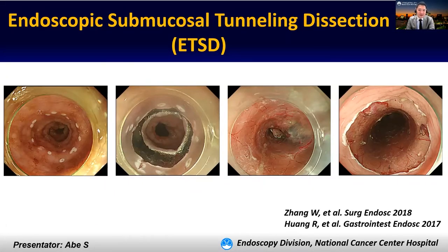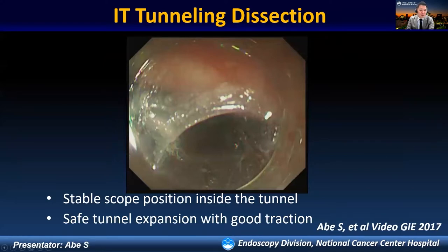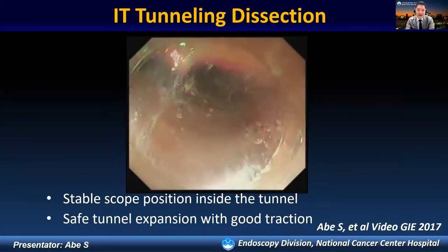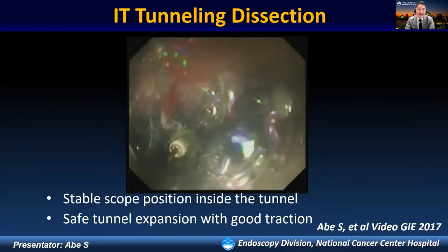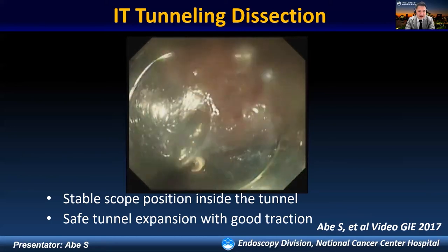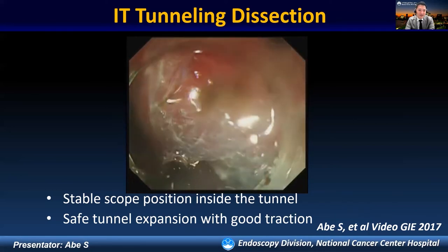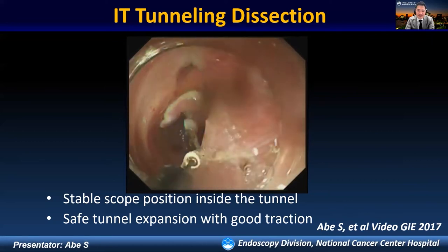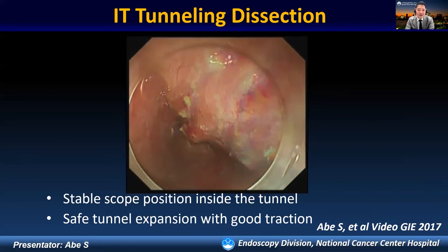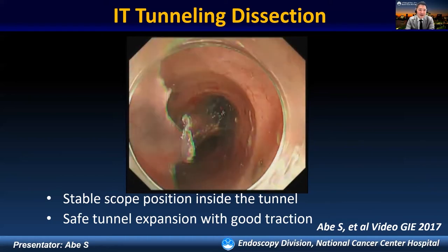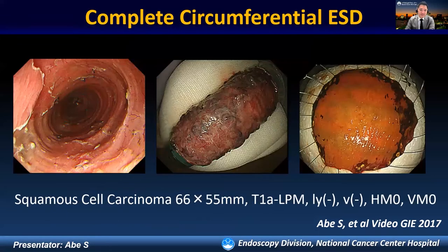Endoscopic submucosal tunneling dissection was developed and reported mainly from China. Similar to the POEM procedure, after entering into the submucosal space, the submucosal tunnel is extended distally with the backside electrode of the insulated tip while traction is maintained. After completing the tunnel creation, we dissect laterally on both sides, expanding the tunnel with good traction inside the tunnel. Even for circumferential lesions, we can perform en-bloc resection. Here you can see the syringe-shaped specimen, and opening the specimen reveals an en-bloc R0 resection.